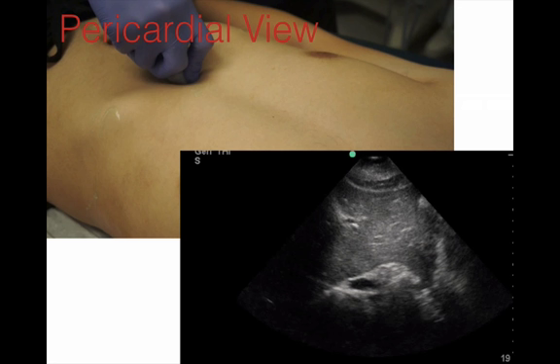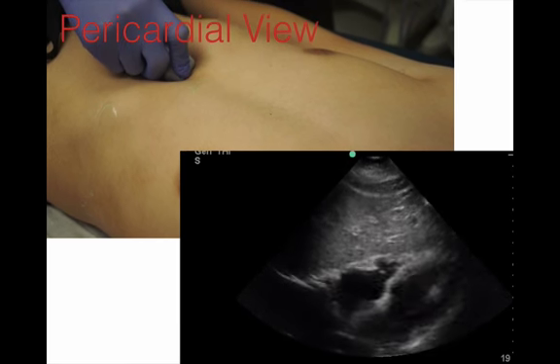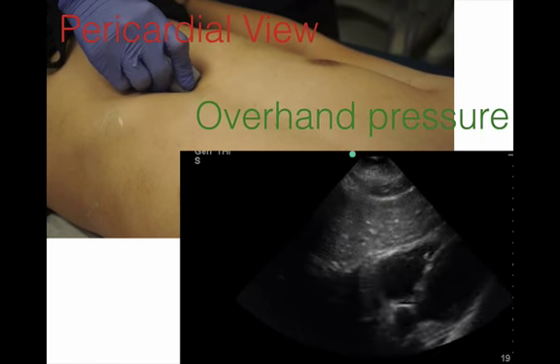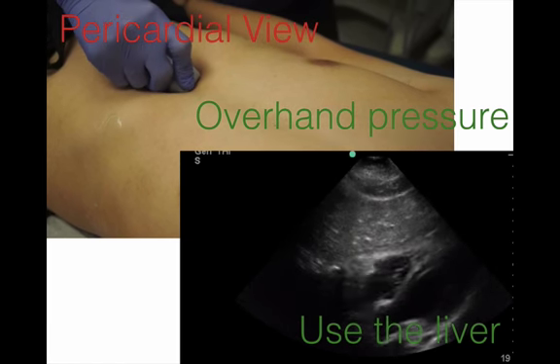So in terms of holding the probe, you need to actually have an overhand grip because you're underhand. So when you apply gentle pressure right here and you fan flat in order to image the pericardium, your knuckles will not be below the probe, and therefore you won't knuckle the patient's abdomen. So again, overhand pressure, fan flat, and then use the liver as your acoustic window.